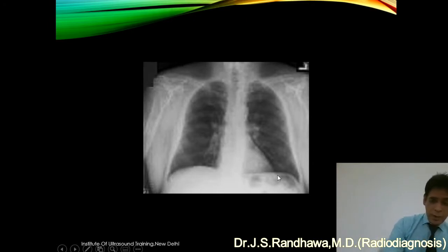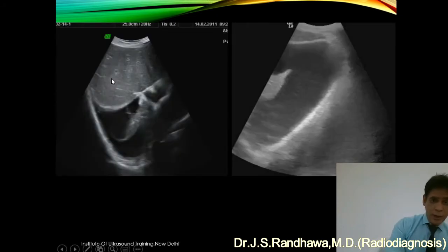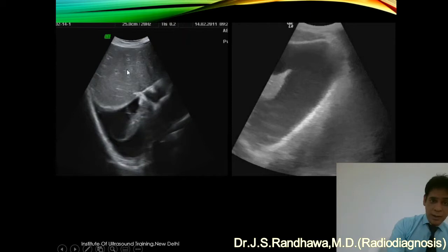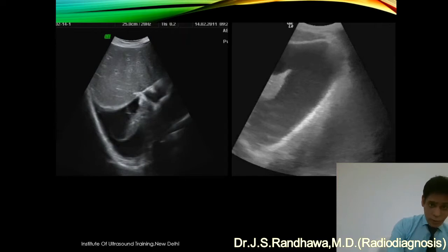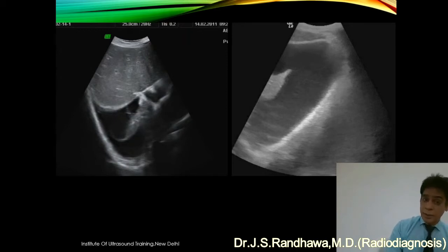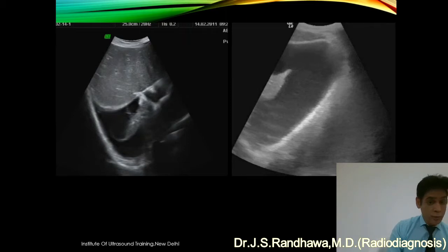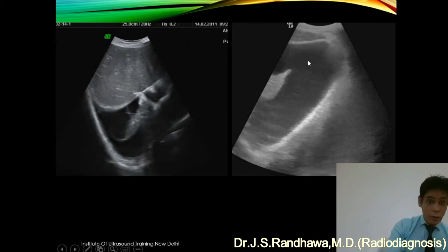Now let us go on to this picture. Here you can make out the probe is kept transversely, and we are getting a transverse section with the liver on top. This is the right side and this is the left side. We can make out the collapsed lung and fluid around it, so just by seeing the collapsed lung and fluid around it, we can make out that this is pleural effusion.